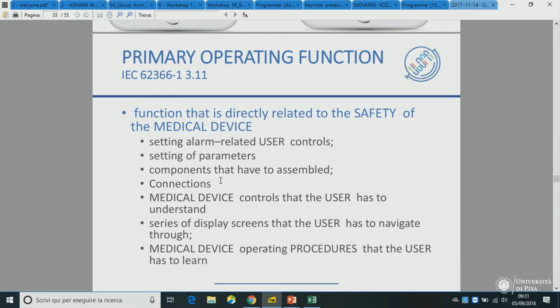Last week, I have been testing the blood banks. Alarms were not automatically resetting around the temperature set point. So I was able to set the blood bank at 4 degrees, and the alarms were ringing at 7, the low temperature, and 15, the high temperature.